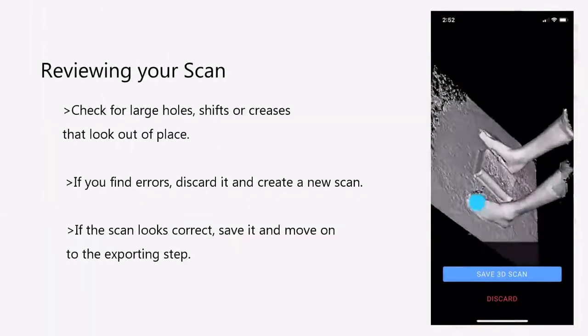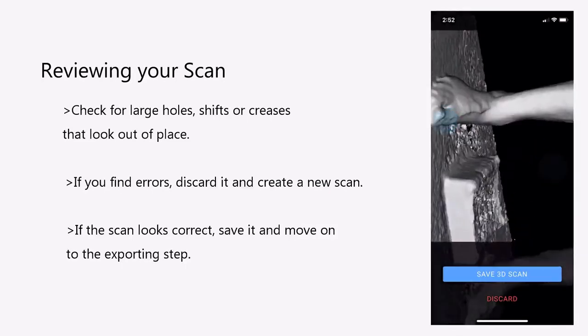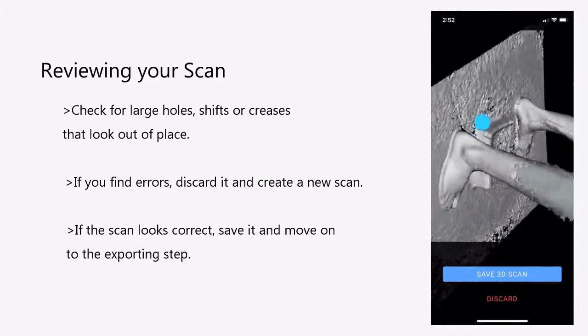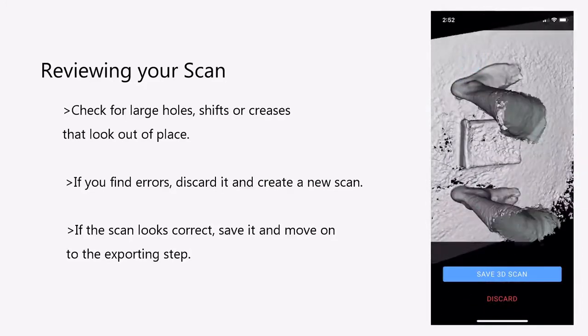Review your scan. Do you see any large holes in the feet? Do you see any large lines or shifts in the scan? If you do, you'll have to start the scan over. If the scan looks good, select Save 3D Scan.